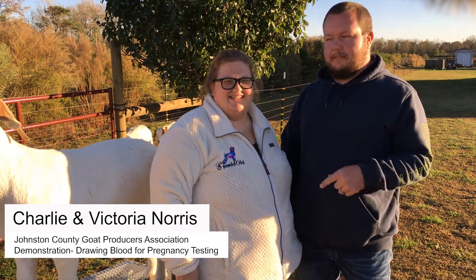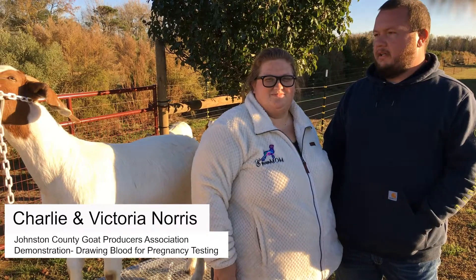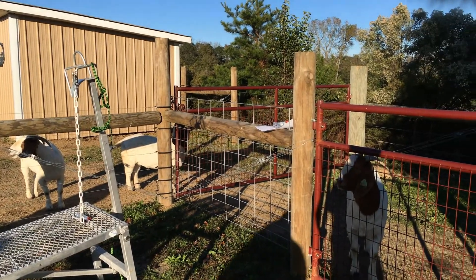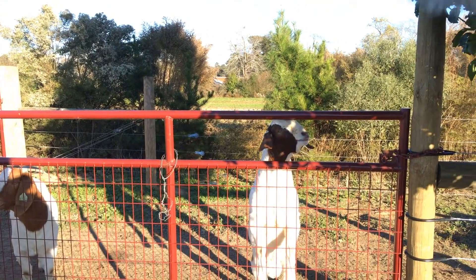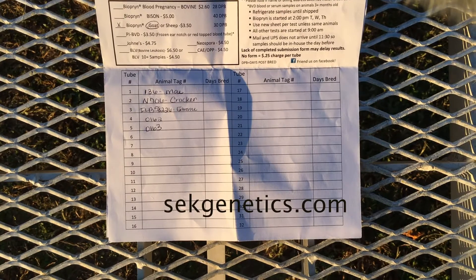My name is Charlie Norris, this is my wife Victoria. We got about three does that we've bred and they're about somewhere between 32-35 days post breeding. We tried to do some blood samples today. I'm going to send the samples off to SCK Genetics and they're out of, I believe it's Galesburg, Kansas.